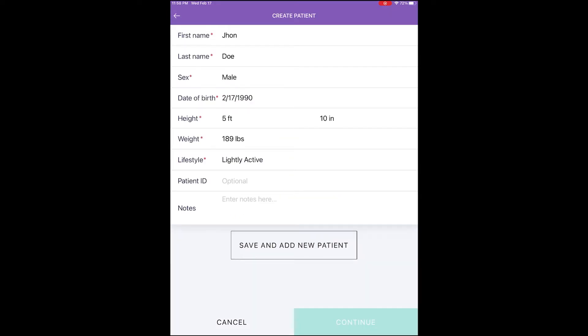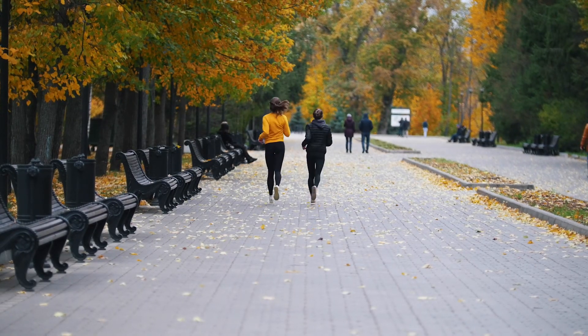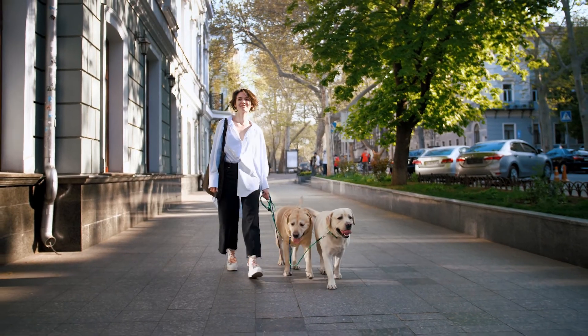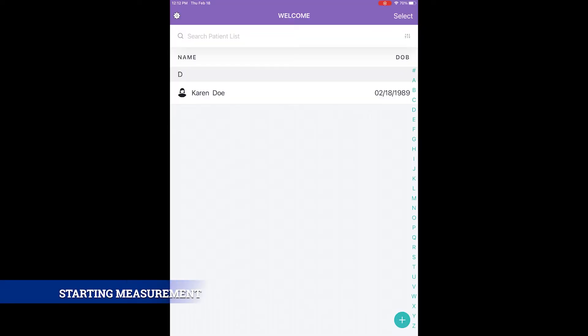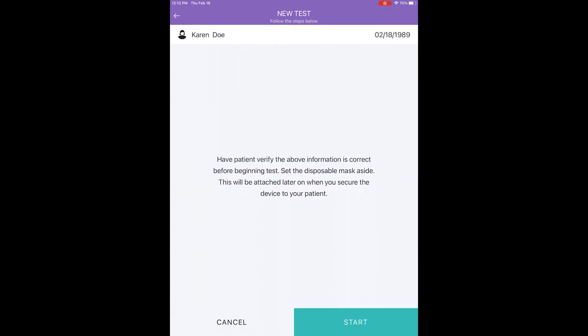Step two: Verify Patient Info. You must complete the patient profile entering the date of birth, height, and lifestyle, with the understanding that lifestyle does not take into account exercise activities — it only considers the type of daily work activities. For most people, sedentary is the correct category since they remain working at desks, offices, or benches most of the day. Then tap New Test to begin. If the patient was previously added to the patient list, click on the patient's name and tap New Test.